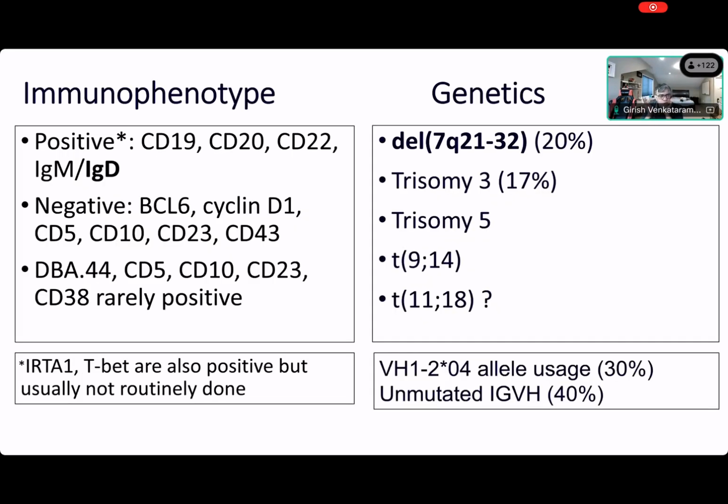I know I'm showing you a slew of stains that comes in the WHO book, but looking at the immunophenotype, the only useful stain here is probably CD20, right? And all the other stains are pretty much useless. CD5 and CD10 and all of these stains, people will diligently do all of these stains to exclude mantle cell lymphoma, follicular lymphoma, but morphology is key. If you have a sinusoidal pattern exclusively in the bone marrow, you're probably dealing with a marginal zone lymphoma. It's very unlikely to be a follicular lymphoma.